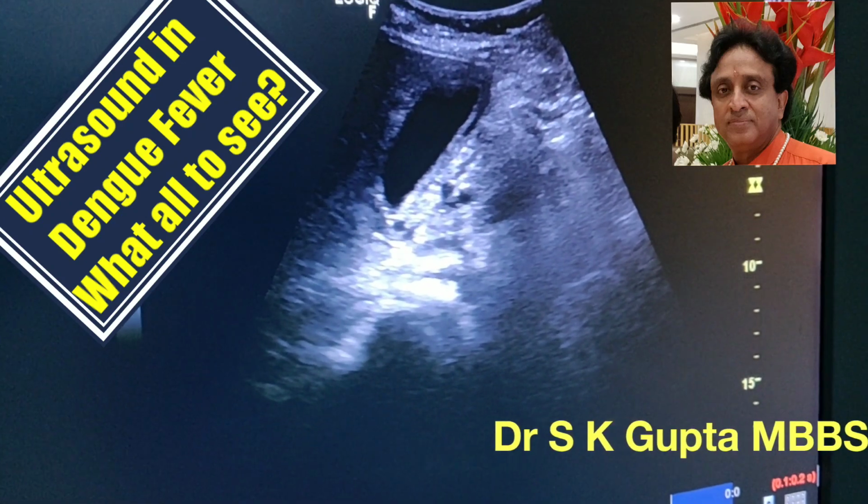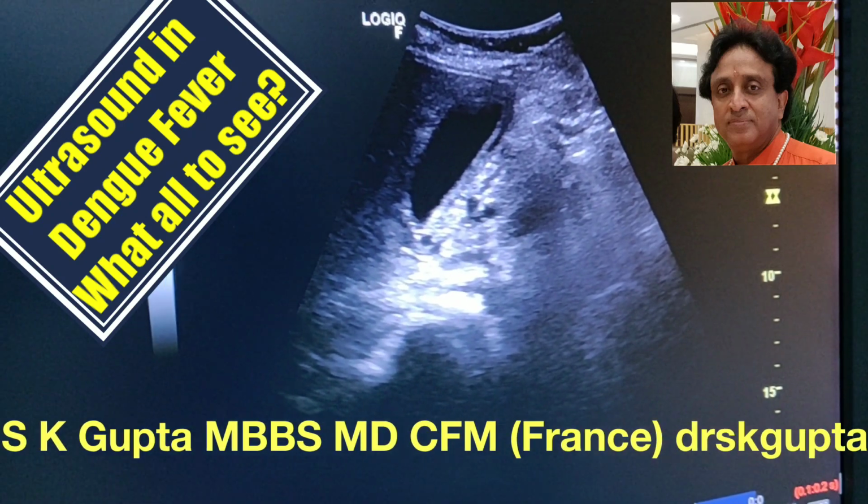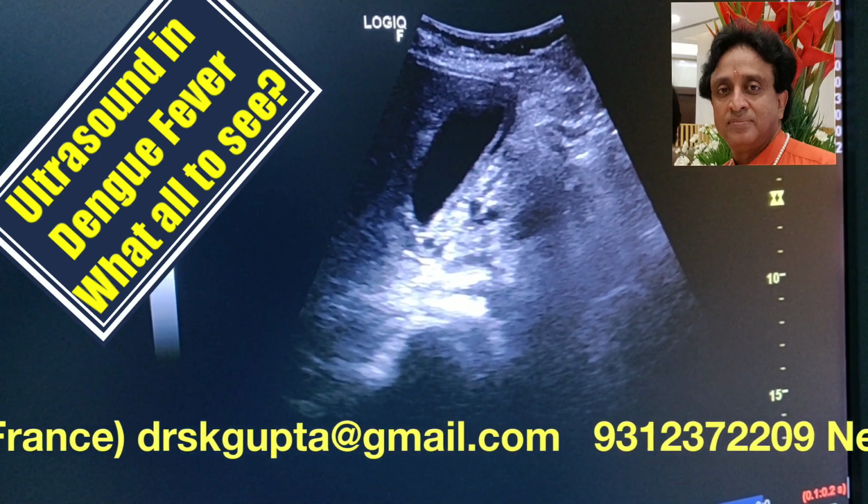Friends, today we are going to present a case of dengue fever to you. What all do we see on the ultrasound in dengue fever?